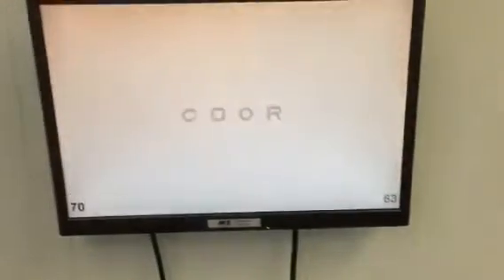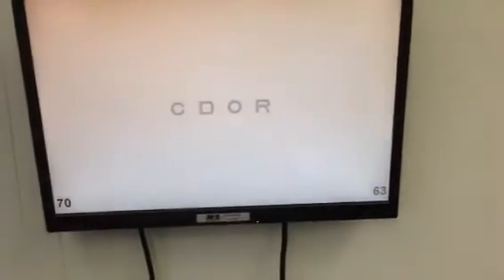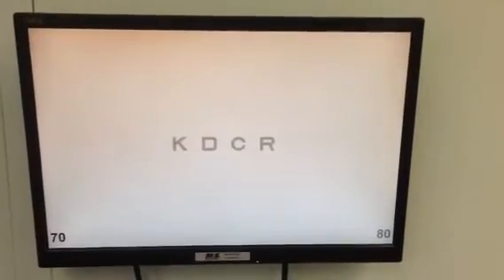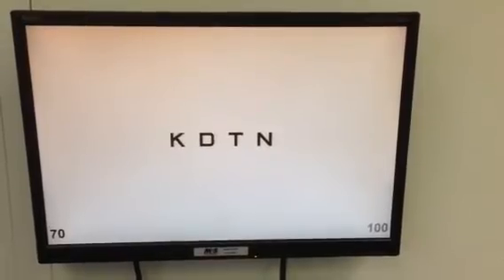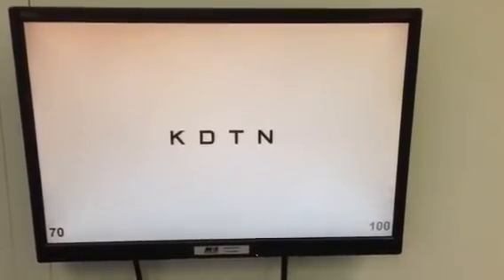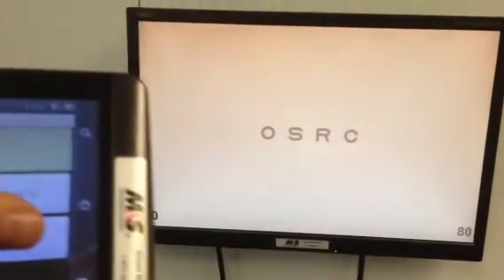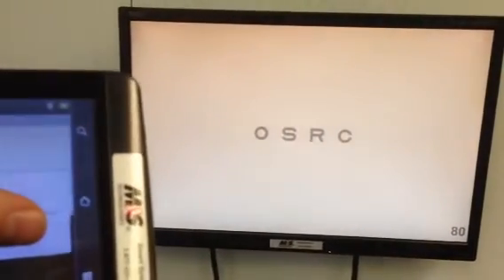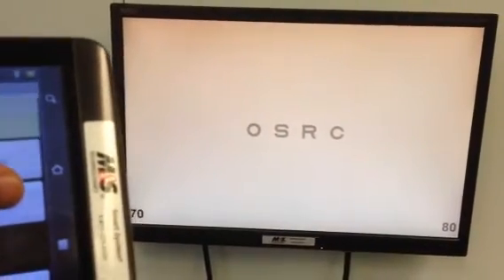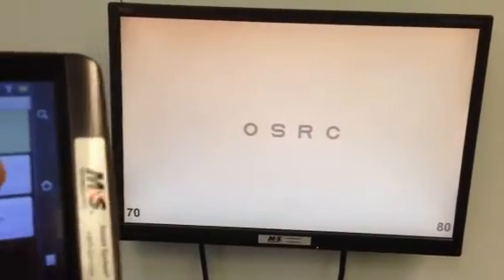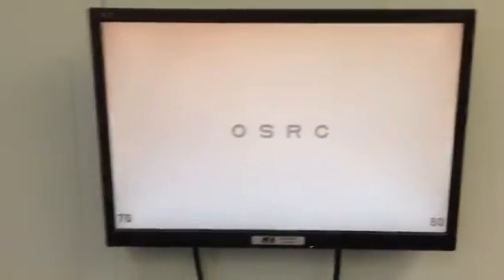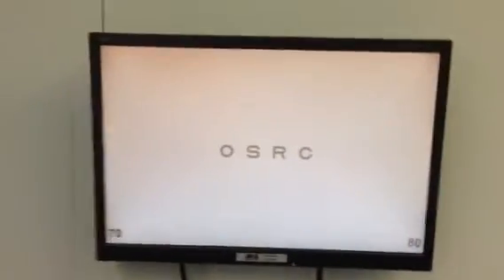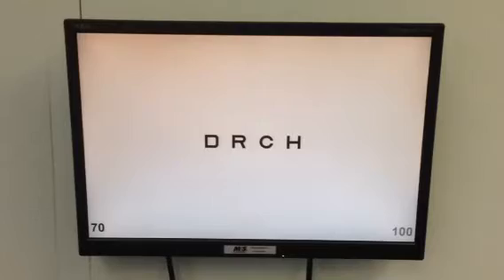The alt up and down button is probably a better bet for you. And for alt up and down what you want to do is then change the contrast percentage. Alt up is going to change to higher percentage contrast and the alt down button is going to change it to lower percentage contrast. And it does wrap around so if you keep just one finger on the screen, it should allow you to go from 100% contrast down to the lowest level, 0.5%. And boy, where are those letters? Very hard to see.